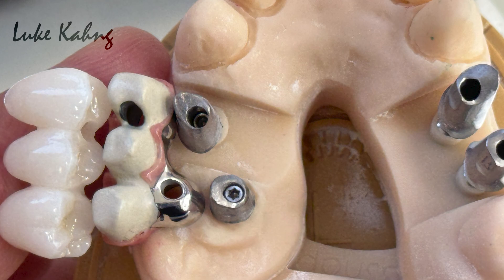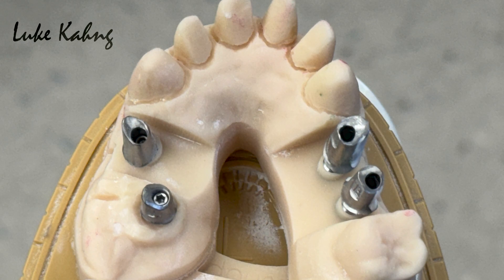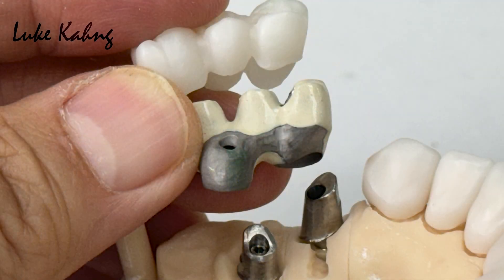Two implants were placed lingually — way far lingual. Whenever we make the regular implant crown, it will fail because the lingual side is really thin, as you can see in my photo. Here is my full information, and we carefully approach the final restoration.